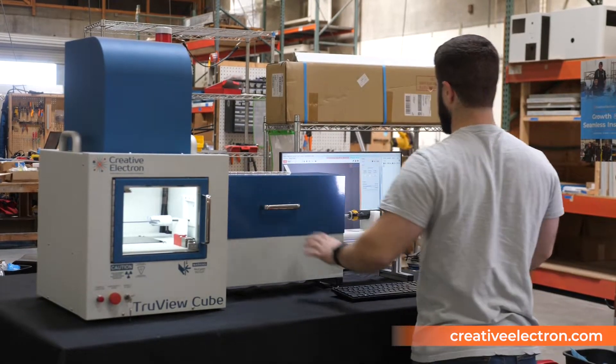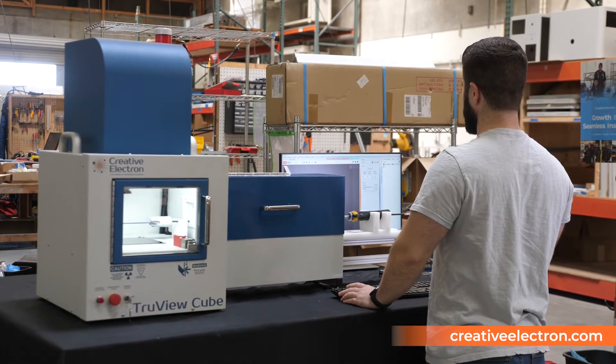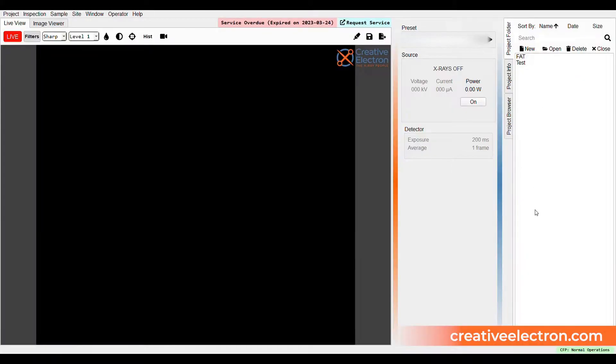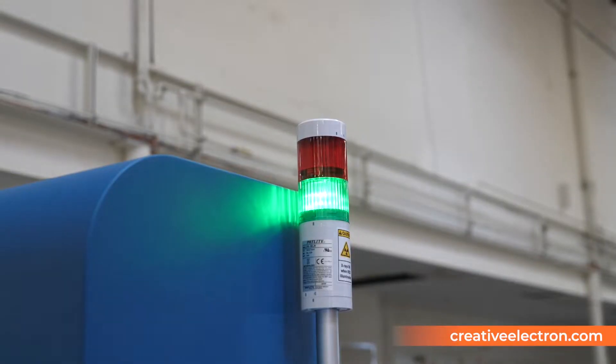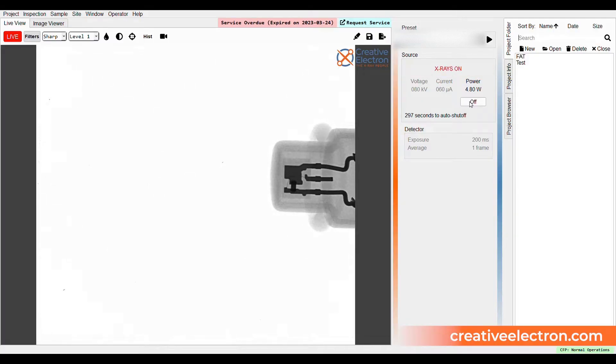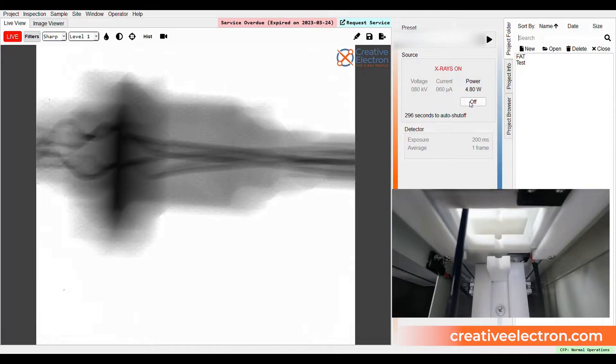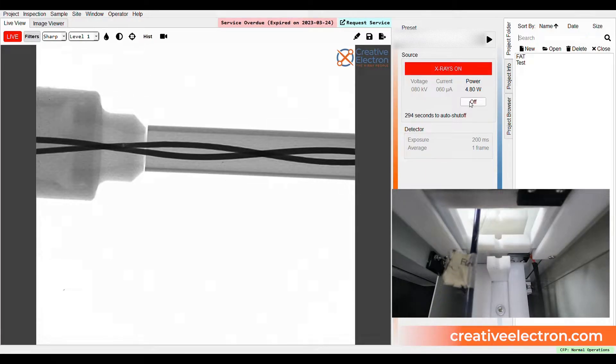To load a catheter into the system, you start by lifting the side carriage box cover. This gives access to insert the catheter into the system through a shutter opening and insert the handle into a sliding handle fixture.